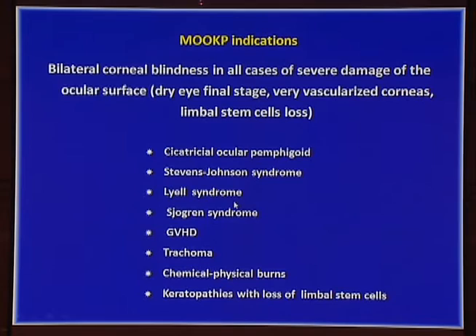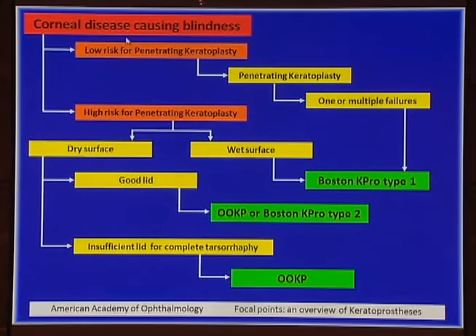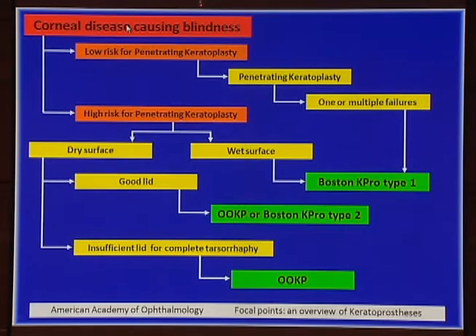And this is a nice scheme which was presented a few years ago at the AAO. And it's very, very interesting because it gives us the complete idea of the pathologies and of the treatment of the same. We see that at the end of the game, the OOKP is the only procedure which is indicated.